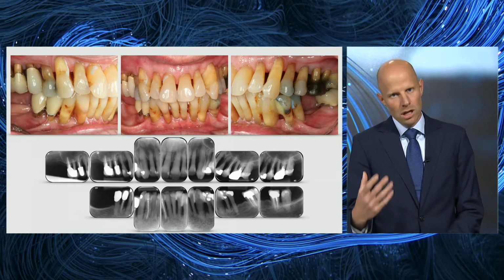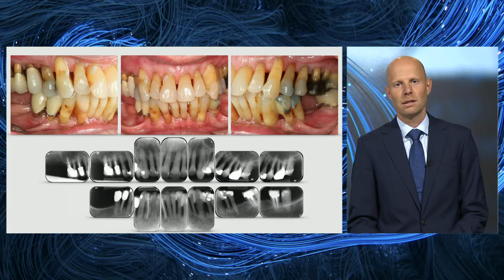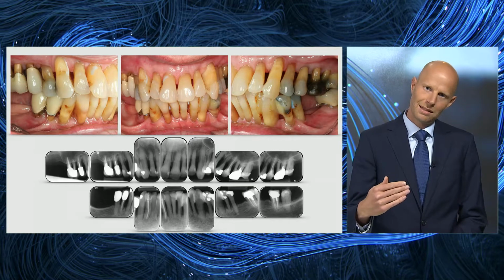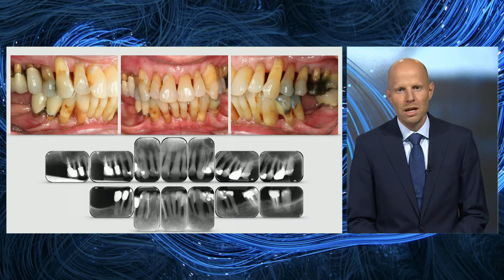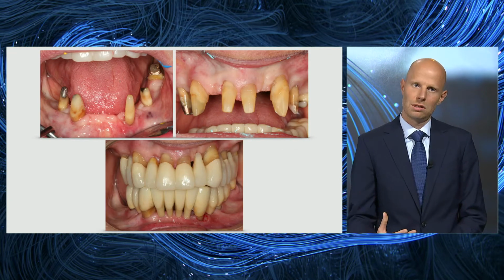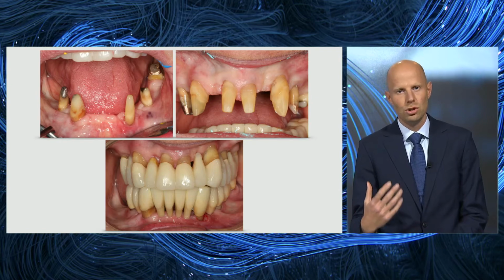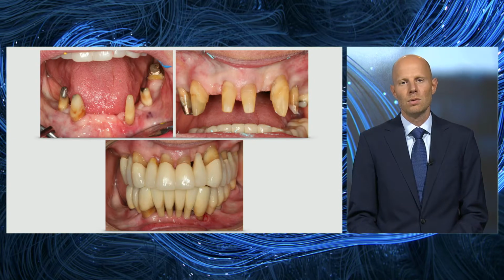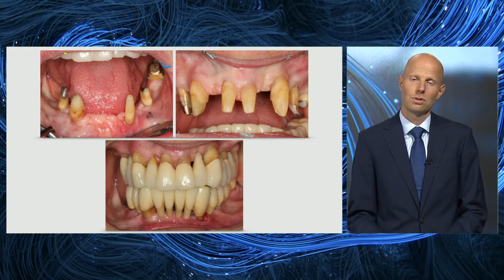We should maybe reconsider such patients in particular that are at high risk of developing peri-implantitis, because we may reconsider using teeth to restore such patients to a larger extent than what we are used to today. So it is patients like these that we may treat with old concepts rather than using implants, and that is what I'm talking about, reducing the number of implants in risk patients. In this particular case, we're using extensive tooth-supported restorations, minimizing the risk for peri-implantitis, of course.